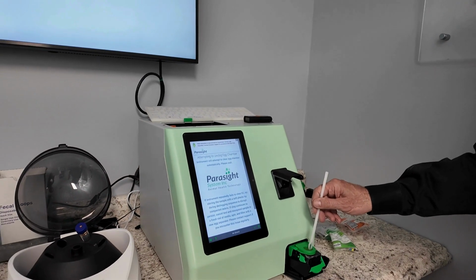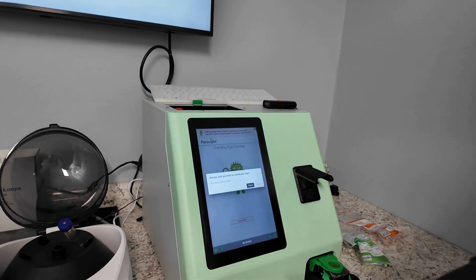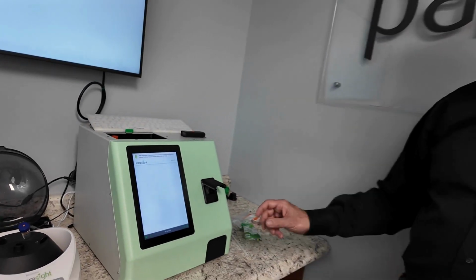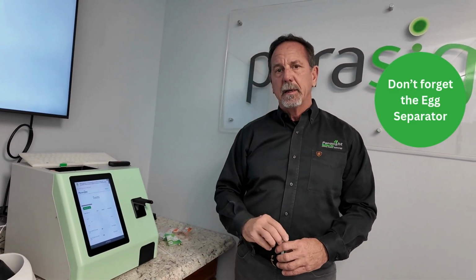It tries several times, and it will give you a chance to cancel the test, and you'll confirm that cancellation. And what you'll need to do at that time is take that egg chamber, throw it out, and try with a new specimen.